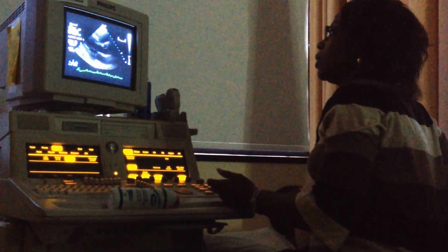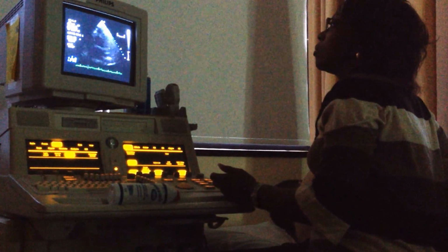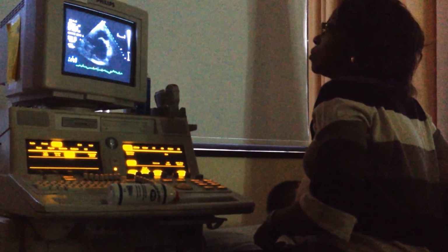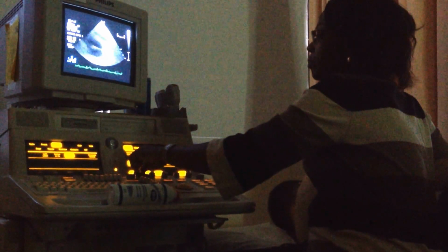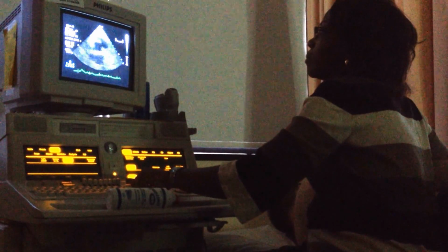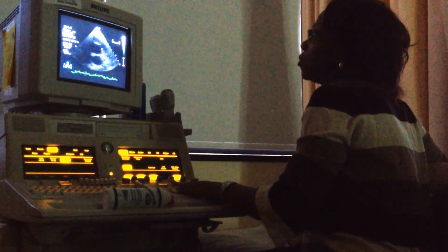So I got my parasternal long. I'm turning. And this time when I turn, I'm at what level? I'm kind of in between because that's aortic and that's tricuspid pulmonic. So I'm kind of in between there. So there's my mitral in the middle. So I'm going to bring up my gain in the middle. There's my base. So I have my aortic here. This is pulmonic. And then sometimes you have to sweep the beam a little bit and rotate a little more.